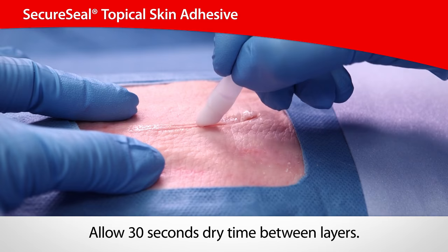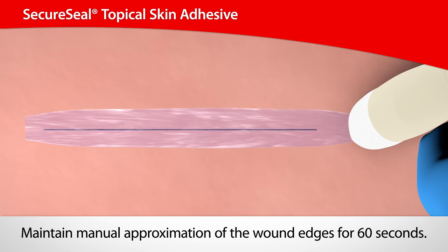Apply the liquid topical skin adhesive in one thick continuous layer or two thin layers. If two thin layers are applied, allow 30 seconds dry time in between layers. Allow the adhesive to polymerize.